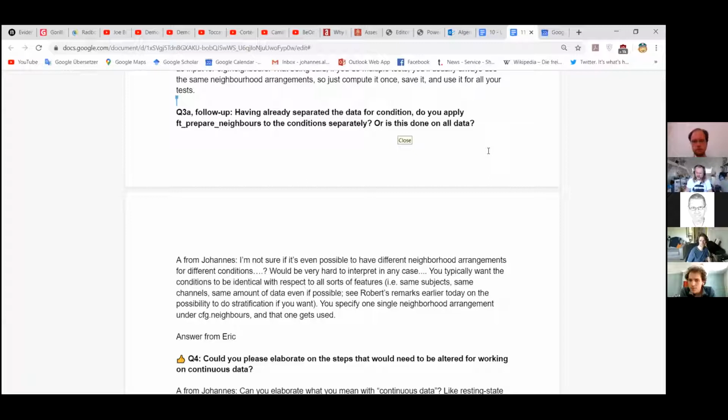If you want to compare the two conditions, you must have recordings from exactly the same channels, and only with respect to those channels can you make a comparison. For non-overlapping channels, a difference is not even defined.